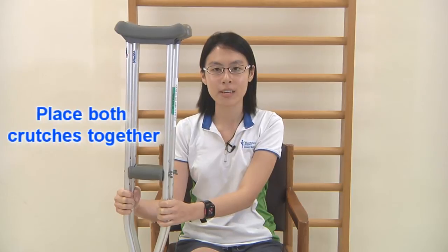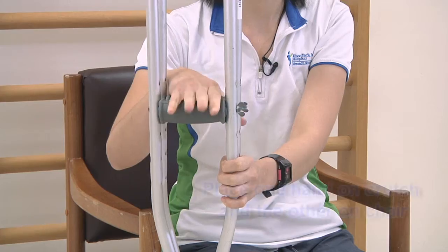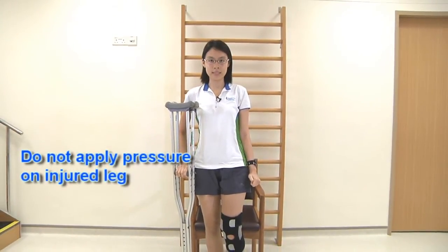I'm going to teach you how to stand up from a seated position in a non-weight bearing situation. First, place two crutches together. Have one hand on the crutch, one hand on the chair and push yourself up. Remember not to place any weight on your affected leg.